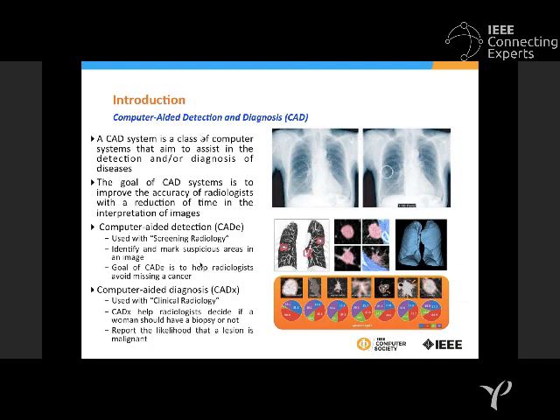So my CAD-X gives a sort of visualization to the doctors and tells them, okay, look, this is the very high risk zone in this particular organ, and the doctors will try to do a biopsy at that particular region. Also the doctor can see that there is not much risk associated with this particular image, and then some other sort of therapy can be applied, not going for the next level of diagnosis.